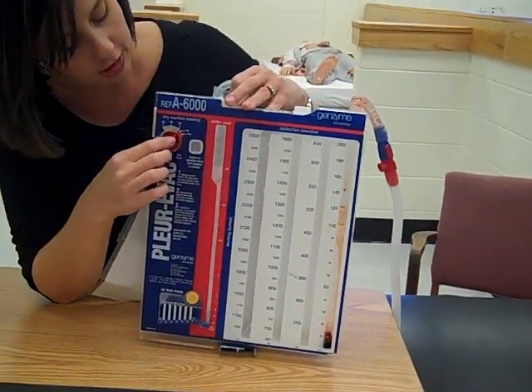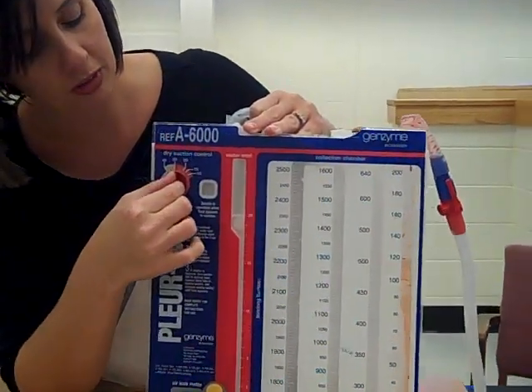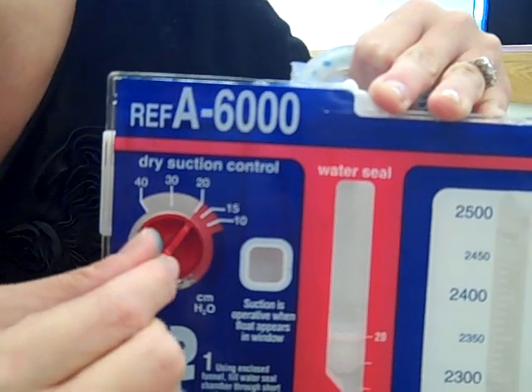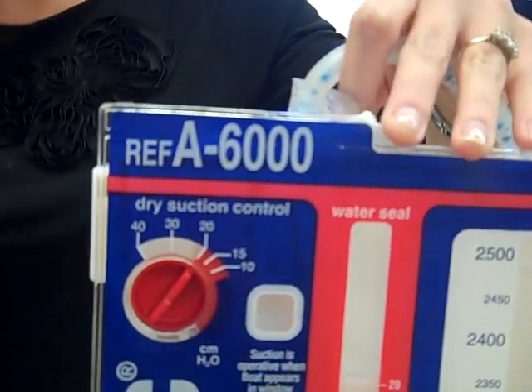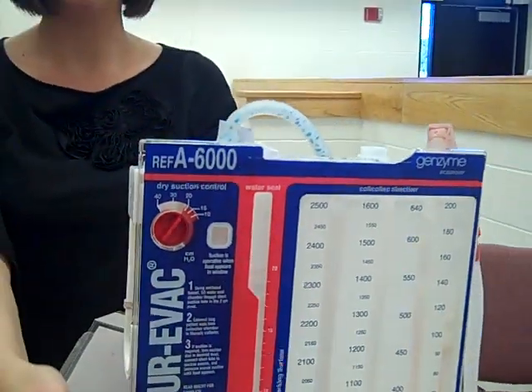The dial for suction is here, and you would just dial it to whatever your prescriptive amount was, whatever the physician deemed appropriate, usually between 15 and 20. So you dial that in. That is pretty much all you need to worry about on here.